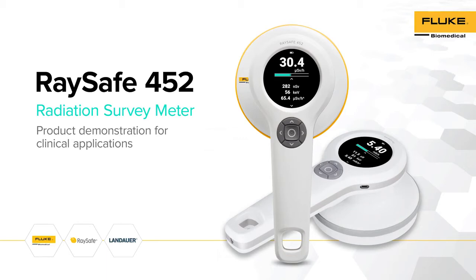Welcome and thank you for choosing RACE-A model 452 as your radiation survey meter. This video will provide an overview of the unique features of RACE-A 452 and demonstrate some examples on how it can be used for different clinical applications involving ionizing radiation.